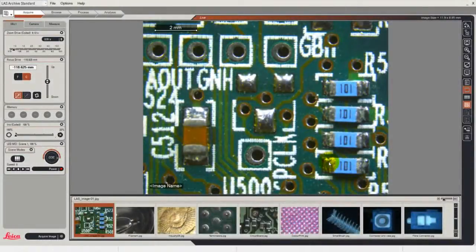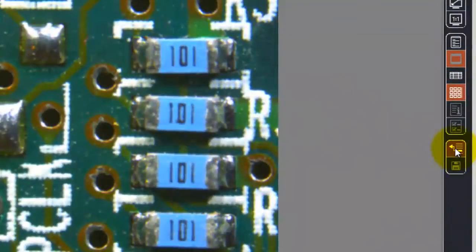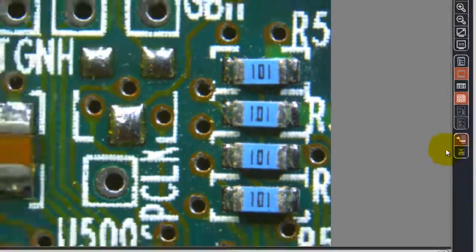In this video we would like to show you a more convenient way of acquiring images by switching the screen display into the so-called dual view mode. We do this by clicking on the icon on the right hand side here and selecting dual viewer.